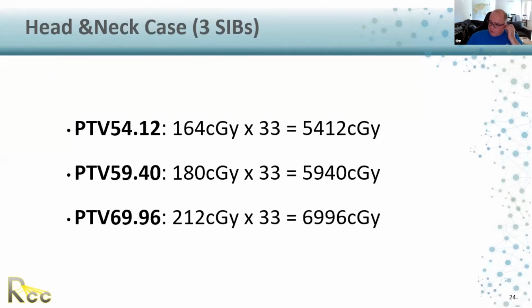Following along with that, we have a question from Ajay. Is there a minimum dose per fraction that should be prescribed? Let's say 150 centigray, or can we go lower for something in a head and neck plan? Sure. So usually for the biological effectiveness, you should not go below 150. 150 should be your cutoff value, kind of. And your maximum also should not exceed 250. So it should be between 150 and 250. This is how they balance it in biological effectiveness.